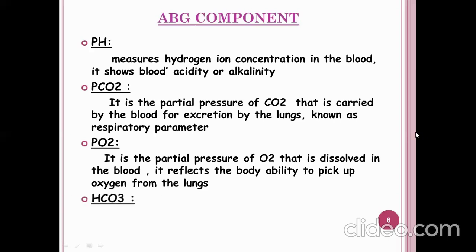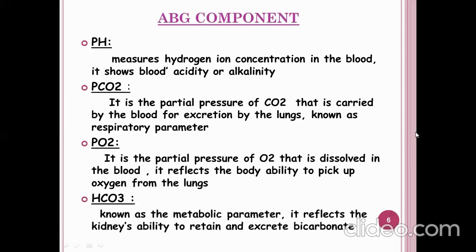Another important parameter is bicarbonate. So this is the metabolic parameter. Keep in your mind, if it is a respiratory parameter, you must know the partial pressure of carbon dioxide. If it is a metabolic parameter, you must know bicarbonate. So bicarbonate is called the metabolic parameter.